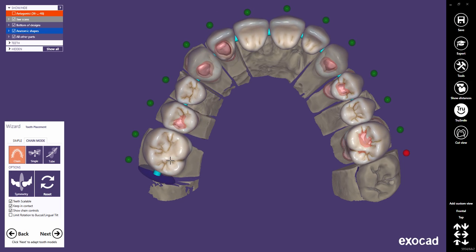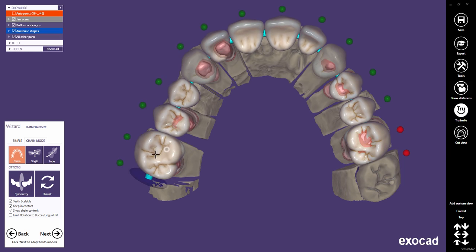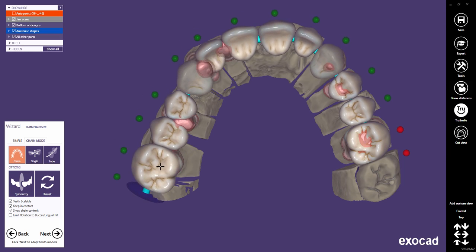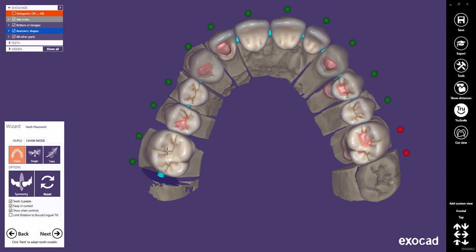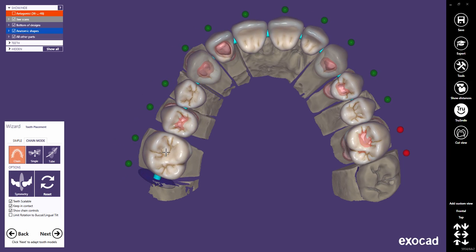If you'd like to completely pin a tooth on its place, click on its green control point — it becomes red. This way, you can lock any tooth at its position.